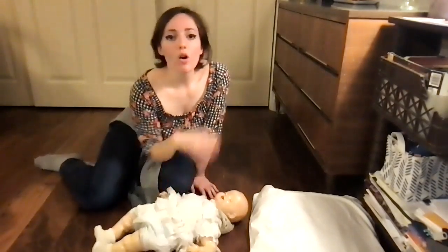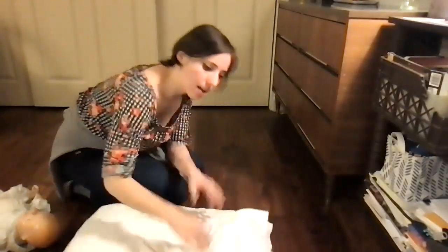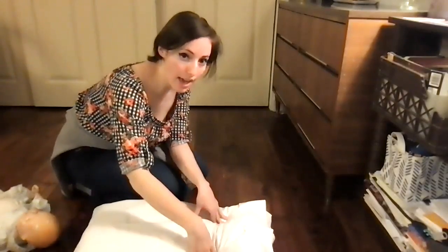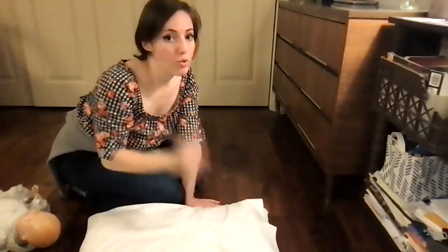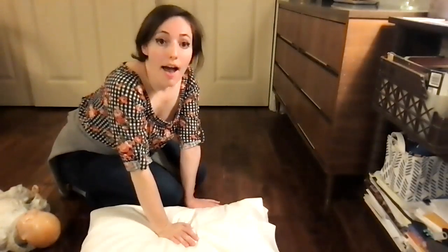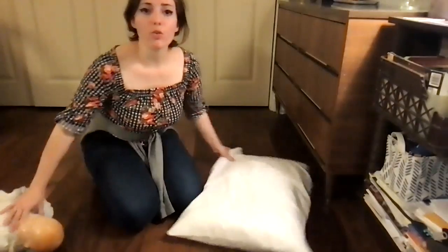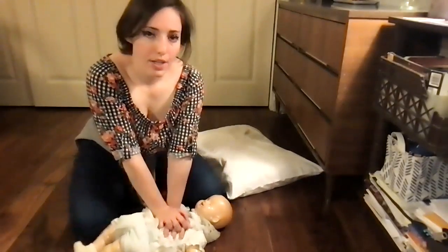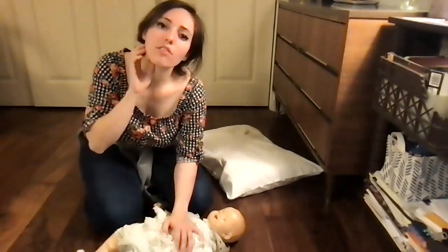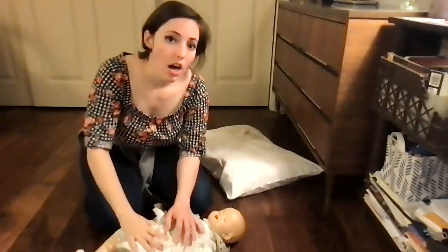Right. Okay. So hopefully in the beginning, you did your whole tap, the "Hey, are you awake? Are you okay?" And then you looked at the person, you called 911, and you told someone to go get the AED. At some point, hopefully that person comes back with an AED. At that point, don't stop or interrupt your compressions. You're going to have that person, if they can, place the pads.